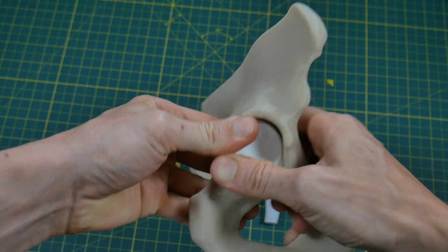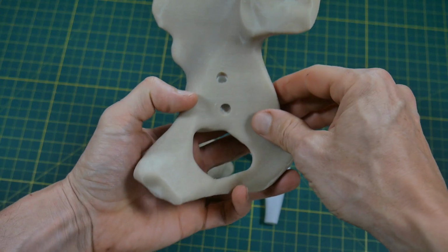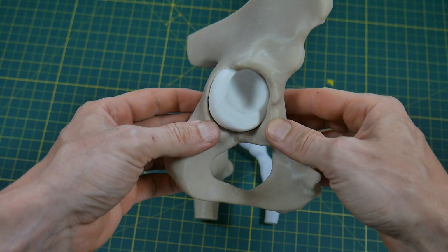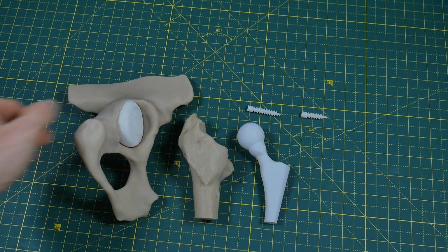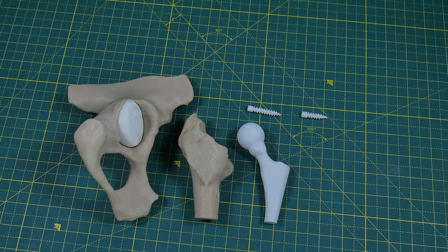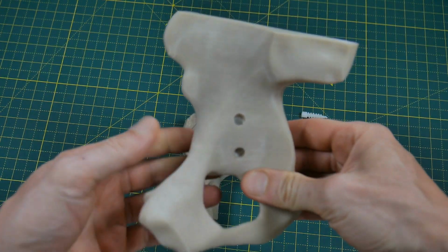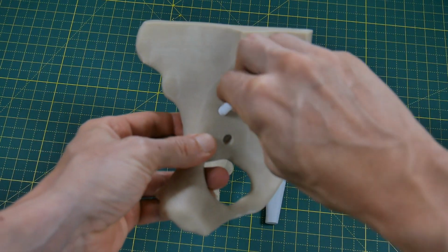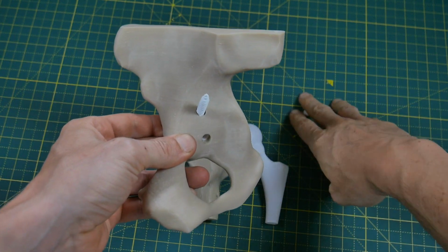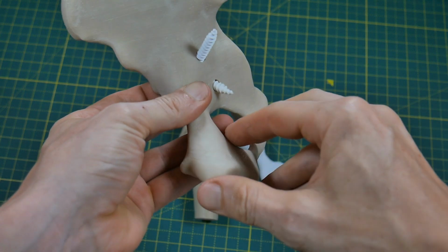After a little twisting and pressing, the socket snaps securely into place. The 2 screws reaching into the lesser pelvis were inserted into the corresponding holes from the backside of the acetabulum.